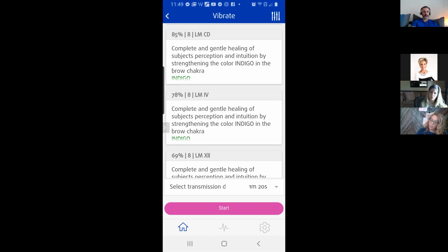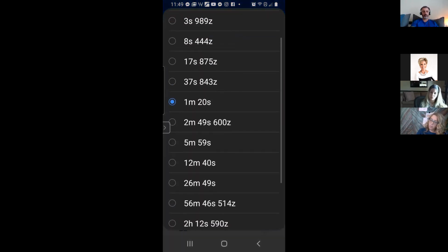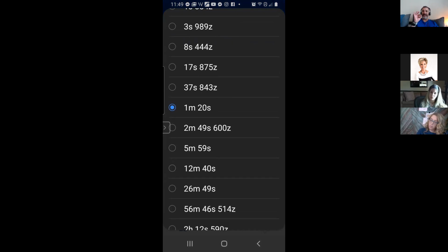And one thing it does is it allows me to choose how long the vibration goes for. Okay, now here's a little bit of a gray area. In general, with these programs, the shorter you run it is for an acute issue, like my boss was super nasty to me today and I don't understand because usually they're so nice and I'm freaked out about it. That's a very acute issue.